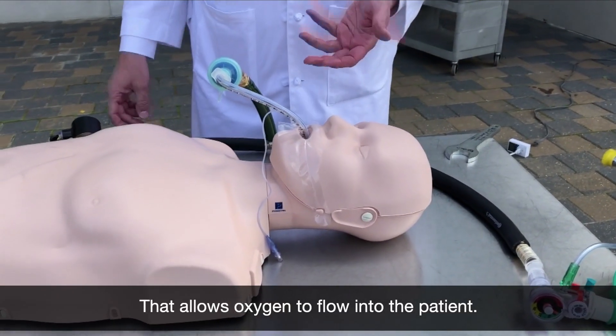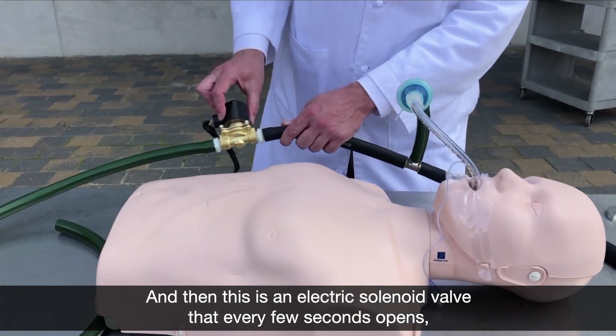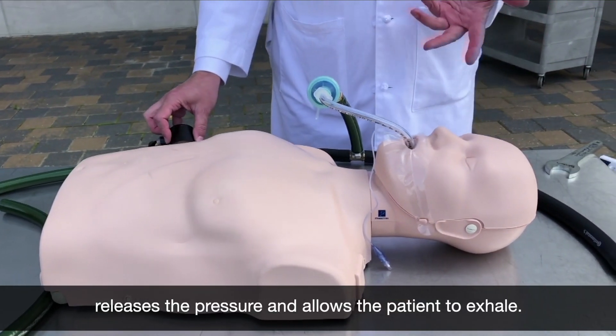That allows oxygen to flow into the patient. This is an electric solenoid valve that every few seconds opens, releases the pressure, and allows the patient to exhale.